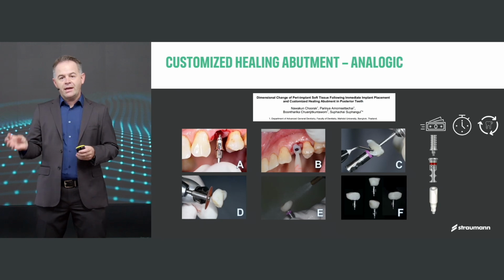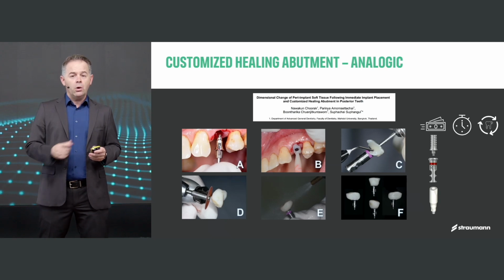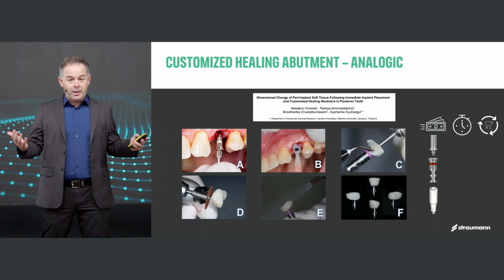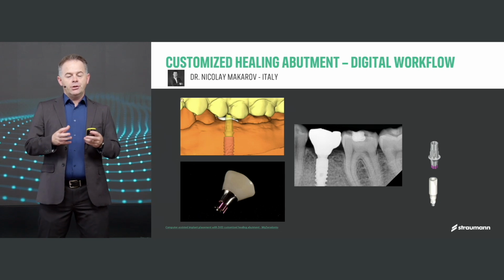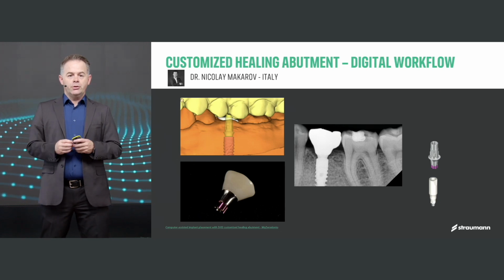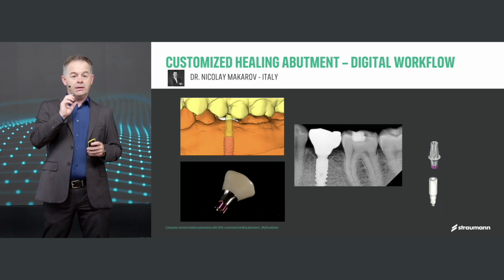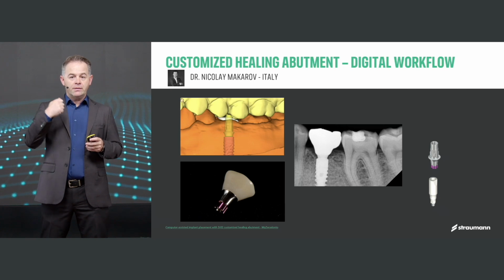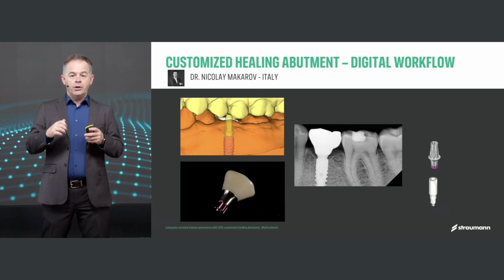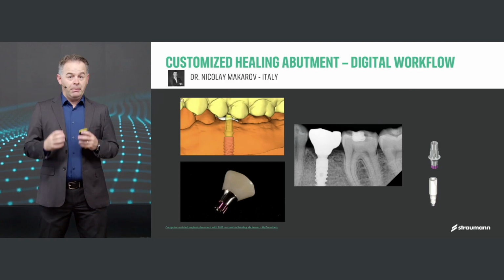And all these different sessions that you have to go through will mean a much longer time to teeth than your patient expected. What is also commonly done is a digital workflow. It's another option too. So right during the planning, you already consider this route. All you're going to do, instead of manually shaping this chairside, is design it in software, and then you're going to have to cement this to an abutment.